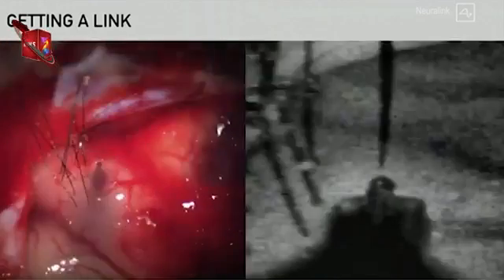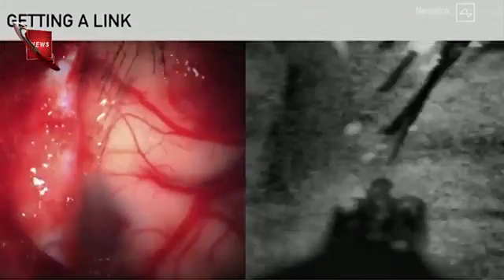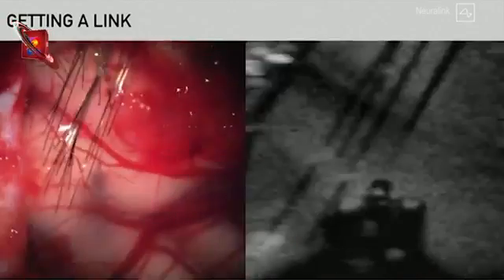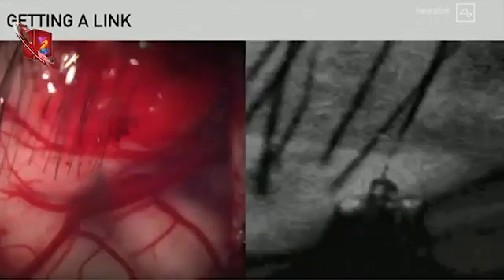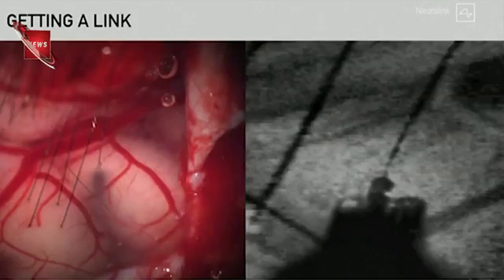So this shows you a close-up view, which I think is actually not too gruesome, of the electrodes being inserted in the brain. And if you look closely, you'll see, a little counterintuitively, that if the electrodes are inserted very carefully, there's no bleeding.